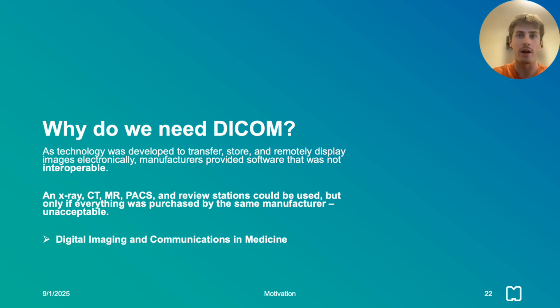This standard defined a mechanism for encoding the pixel data of the images themselves, together with information about the images in the form of a list of data elements. There was little adoption of this standard at the time, and it was not until 1993 that an extensively revised version of the standard was produced, renamed DICOM, or Digital Imaging and Communications in Medicine. Nowadays, the use of DICOM is ubiquitous, and no manufacturer would be able to market a device that did not conform to the standard.